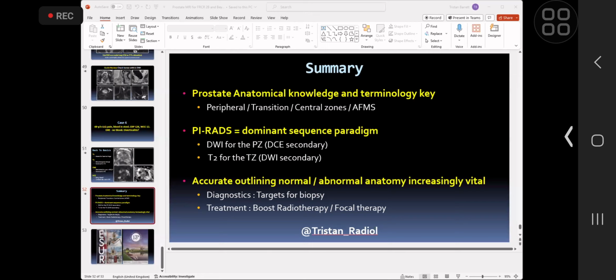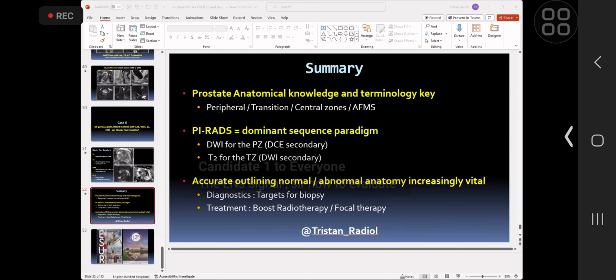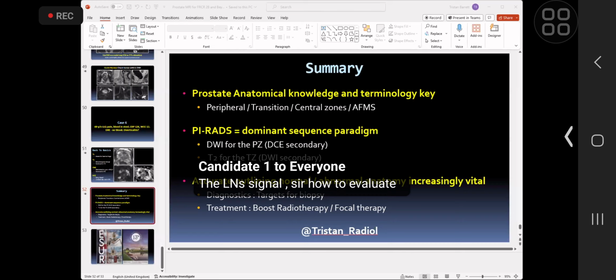The diagnosis of case 6 was the question, that was abscess. Case 7 was the nasty female trick case, female patient. It was a urethral cancer. It was a clear cell carcinoma of the urethra.